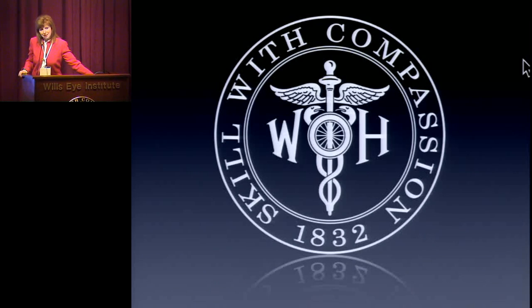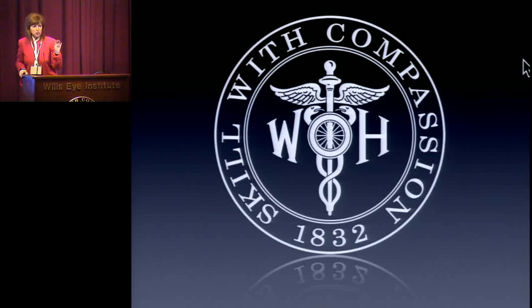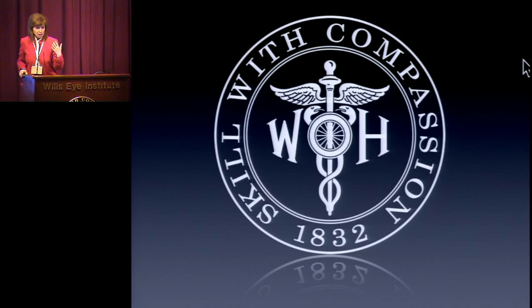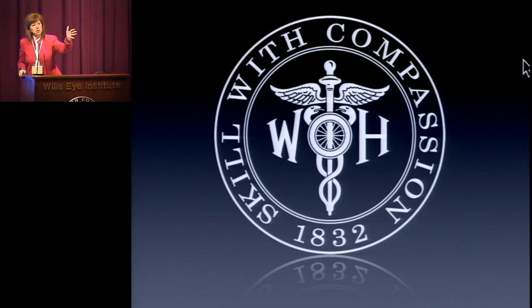Absolutely not. No. I think the reason these machines are never going to replace us is because we have the brain to put it all together. So when something doesn't make sense to me, I do not include it in the whole picture. If the clinical exam is normal, they have a small little cup and they're not a hyperope, so there's no abnormality there, and their visual field is normal.